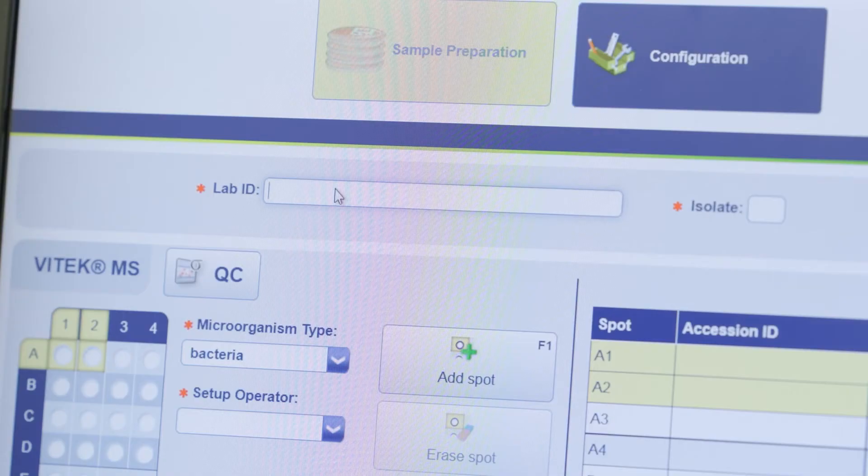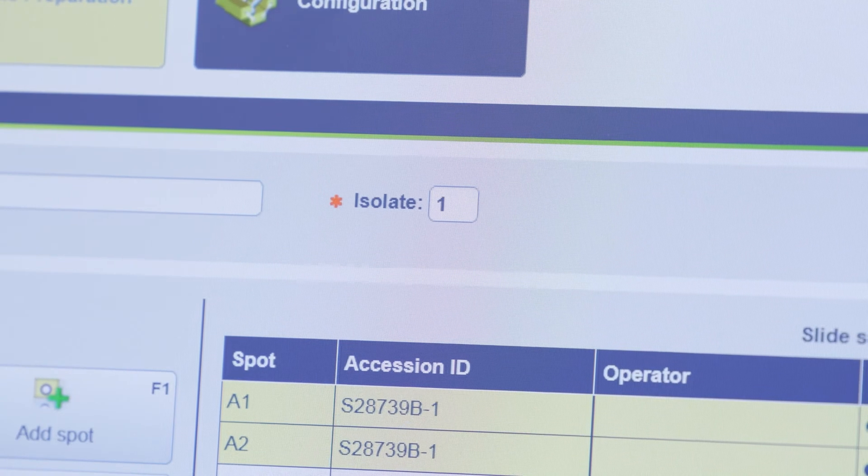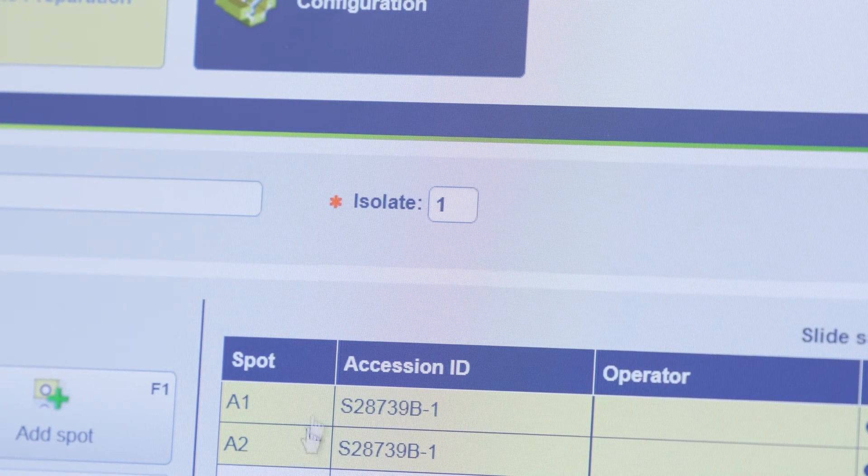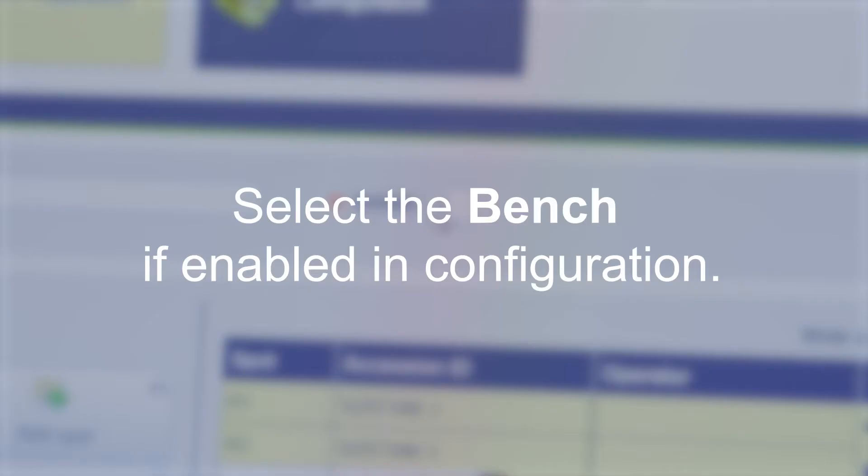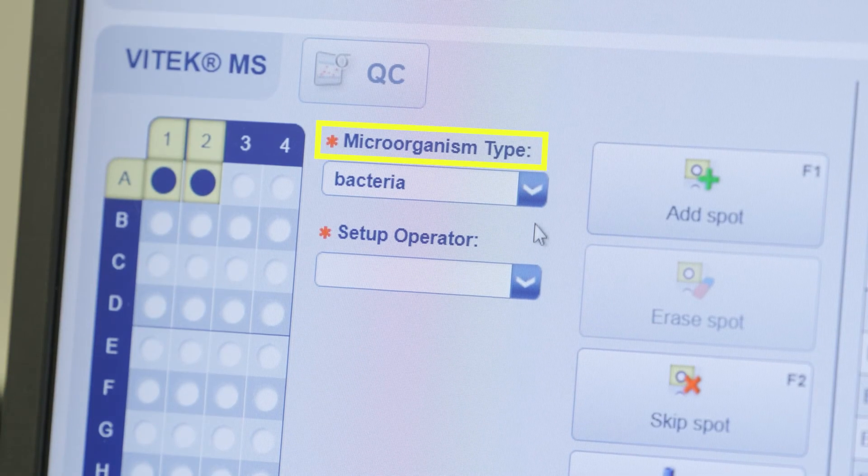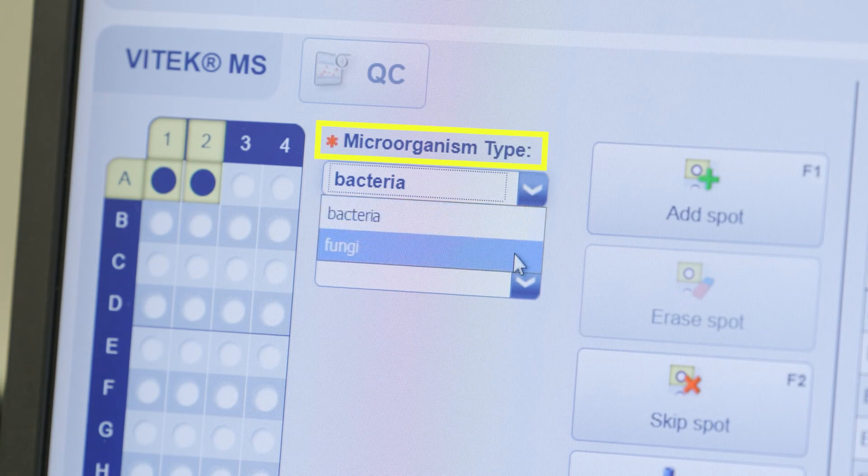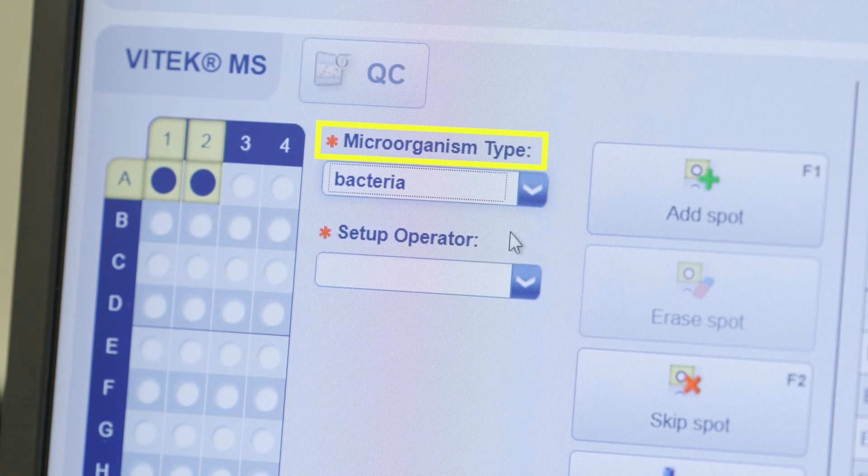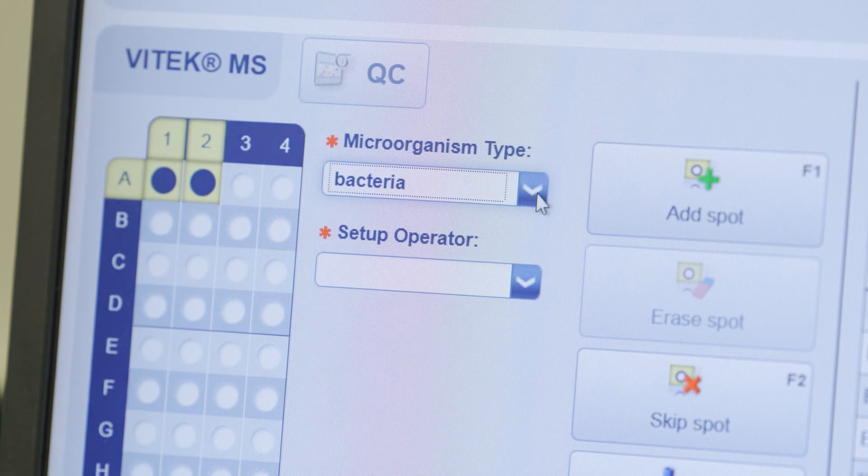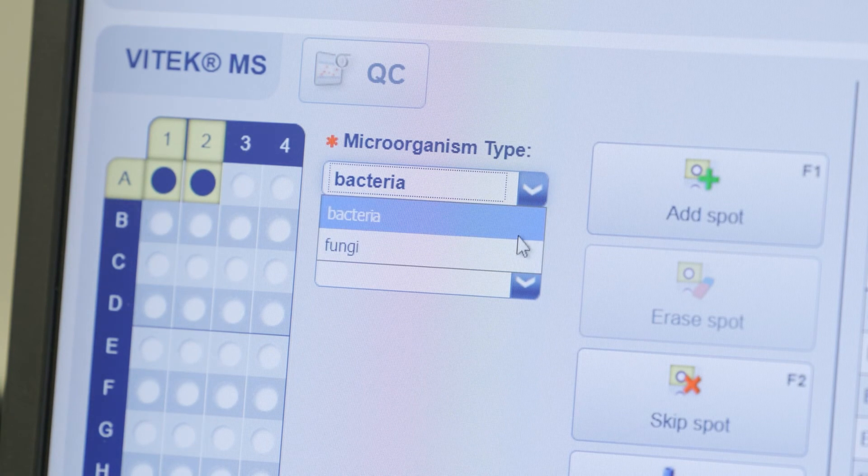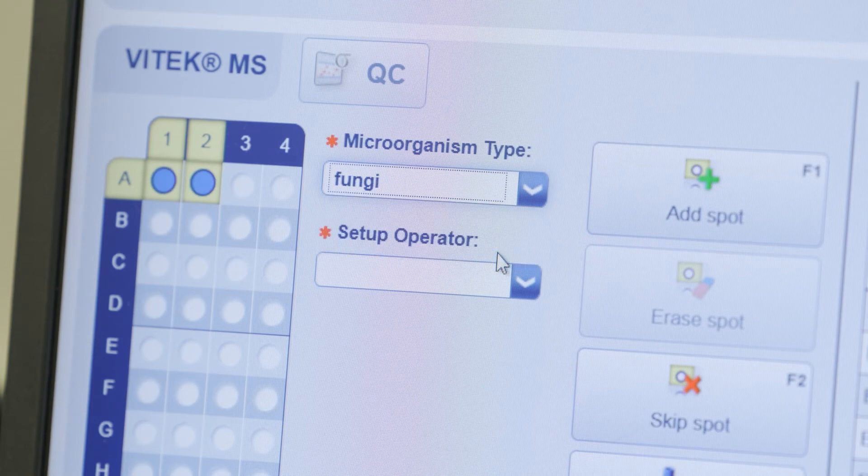Scan or type the lab ID into the lab ID field. The isolate number may be manually edited if necessary. Select the bench if enabled in configuration. Verify the correct option if selected for bacteria or fungi under microorganism type. Spots defined as bacteria are displayed in dark blue. Spots defined as fungi are displayed in light blue.